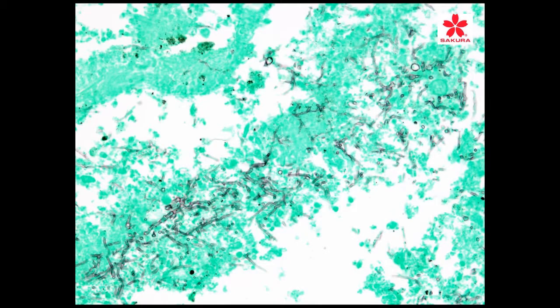So the next slide will actually show you, as it loads up, an example of Aspergillus. Now, what we mentioned before was it grows in this anastomosing type of morphology, where you will have one organism, it will grow by a false type of budding into another organism, and then that will grow into another organism. And what you see here is this anastomosing, or this branching, of fibers from one to another. Typically, they stay in long, elongated structures, which are basically linked, but they're all individual structures.